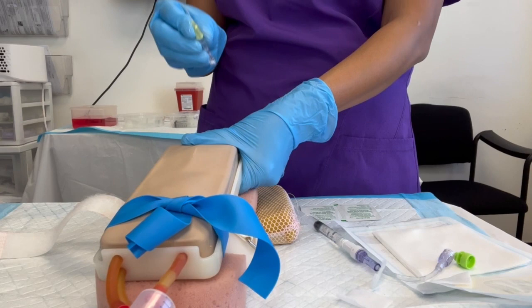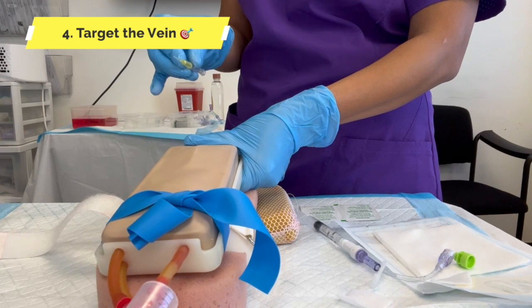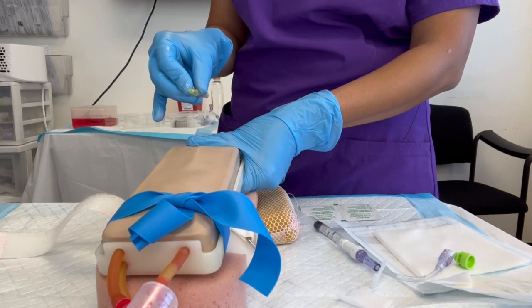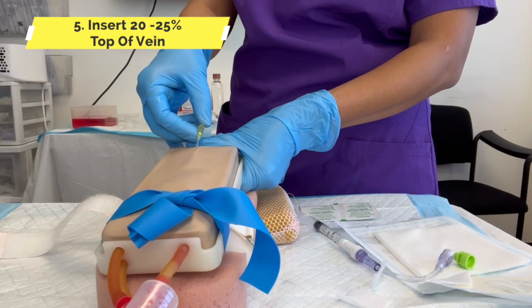Now I'm comfortable with my needle. I have traction — that's step three. Step four: target the vein. Spend time looking for the vein and feeling it so you can target it properly. Step five: poke on top of the vein, inserting only twenty-five percent of the needle — one slide.